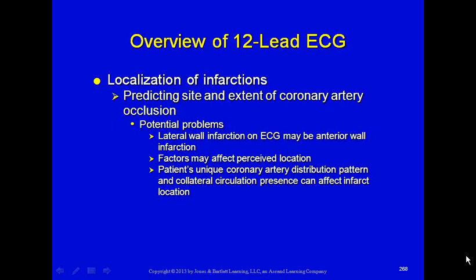So some potential problems associated with infarcts is that lateral wall infarctions on the ECG may be anterior wall infarctions.